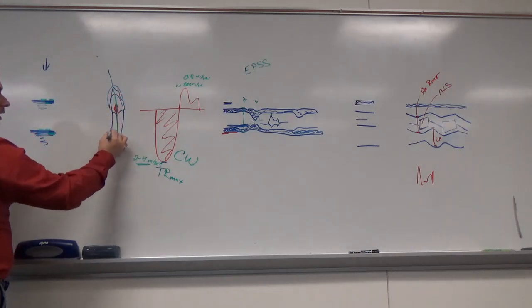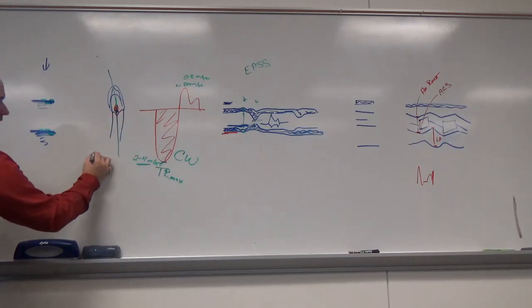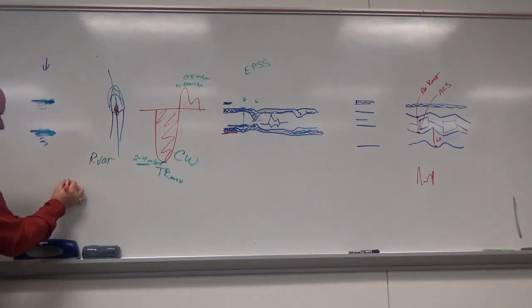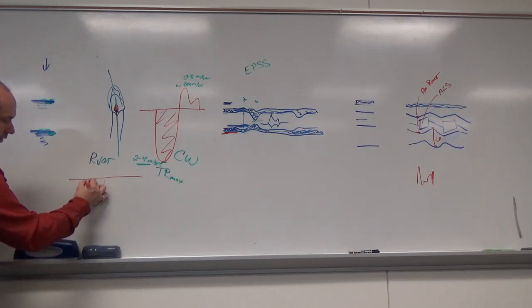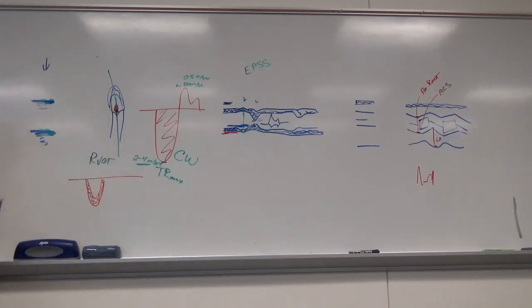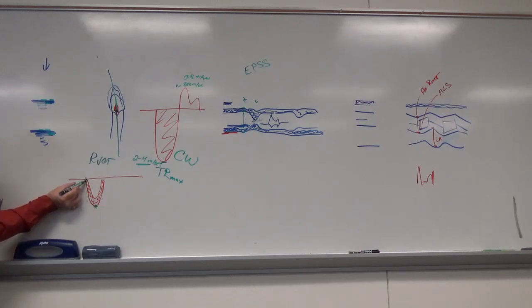The line is going to go through it. We're going to first take a sample in the RVOT. And that is going to look like this. Pulsed wave. It's going to be enveloped. So this is my Doppler signal. And on this one, we're looking for how fast does that come into there. So we're going to measure at the baseline to the peak. And we're going to look at the acceleration time, how fast that takes to do that.